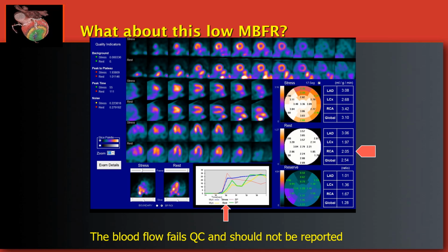It's not a technically good study for the blood flow reserve, even though the perfusion might be okay. So the best thing to do in that case would be to repeat that study on that patient if there's suspicion of coronary artery disease.